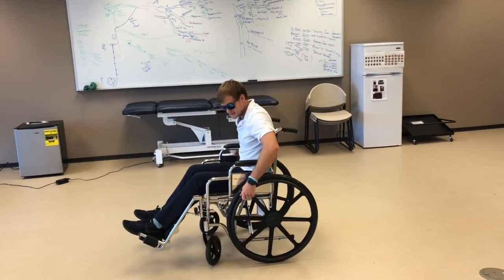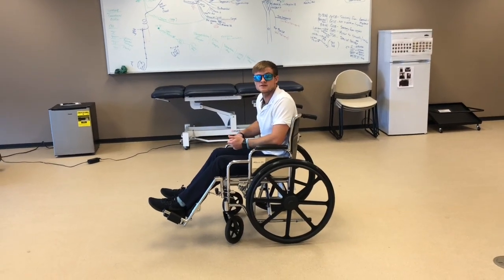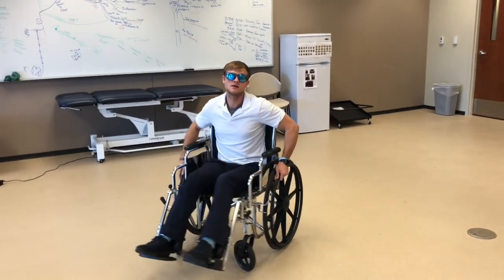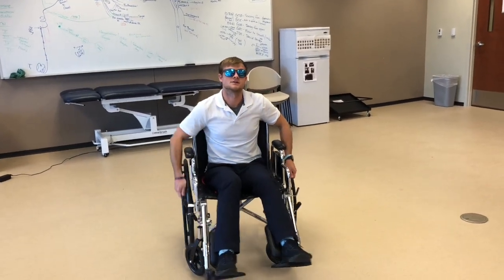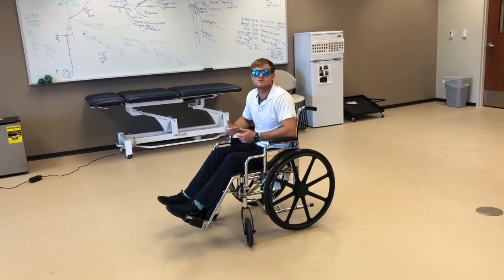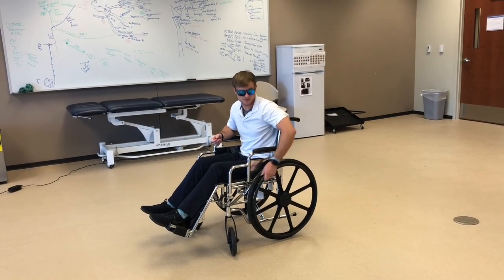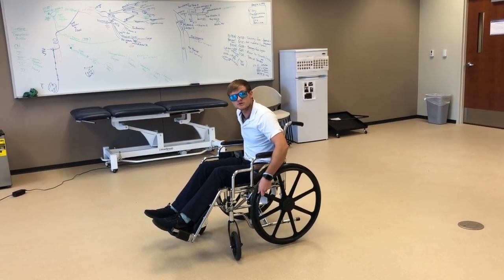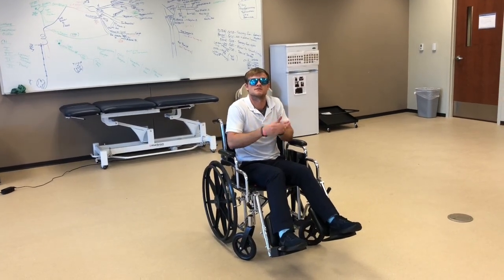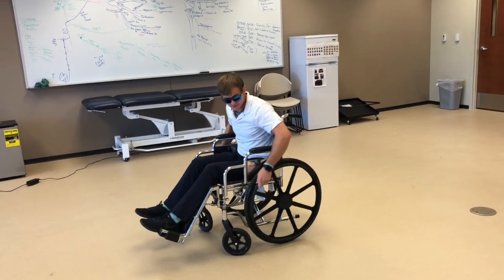Another thing with wheelchairs — I'm going to show you guys how to turn. There are pretty much two ways to do it. You can hold on to the left push rim and push forward on the right, and that's going to cause you to turn. The other way, if you want to turn narrower, you can pull back on the left push rim — 2 to 10 — and push forward on the right, and that's going to cause you to almost do a pivot and turn right on the spot.